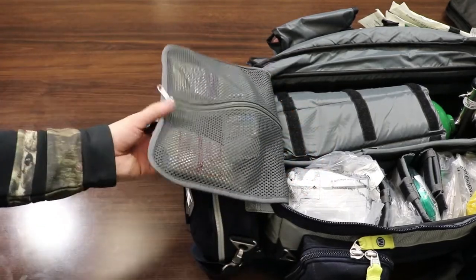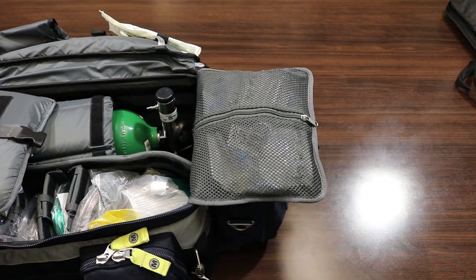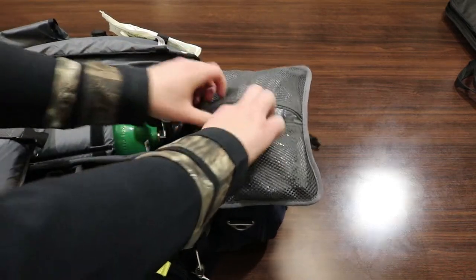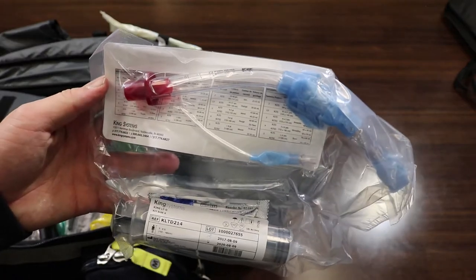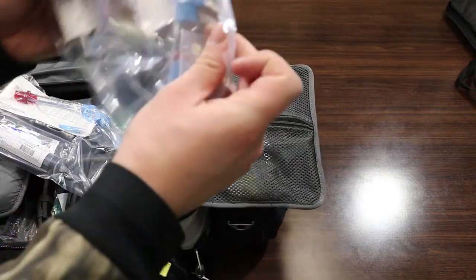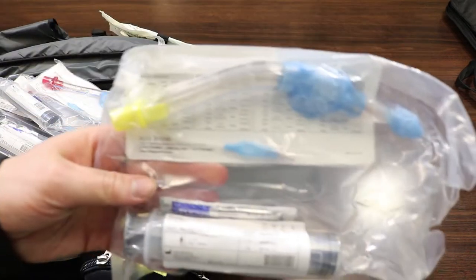Moving over to the right side, this is our blind airway kit, and it is filled with King Airways. We've got a few different sizes: this is a number four, another number four, and a yellow number three.